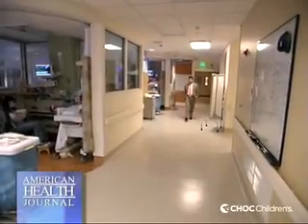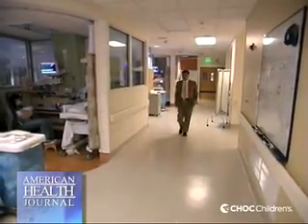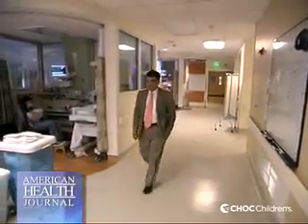There are multiple conditions in the pediatric intensive care world and in the neonatal intensive care world where brain circulation, even after birth, for example, after cardiac surgeries, can be compromised. The oxygenation to the brain can be compromised, and potentially we can apply this therapy during the period we are working on the heart or working on the lungs to protect the brain. This holds great promise in that field.